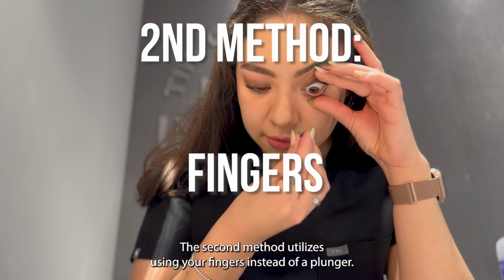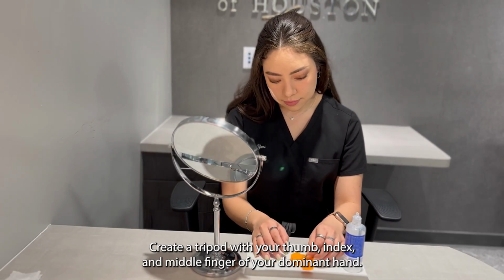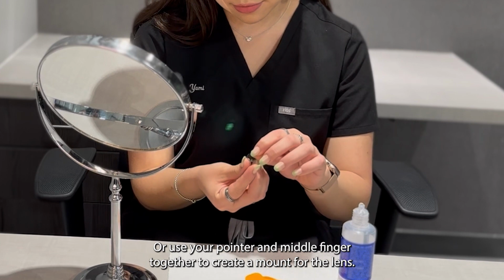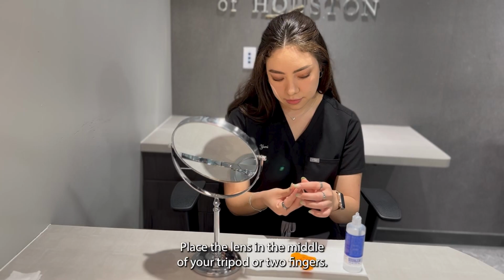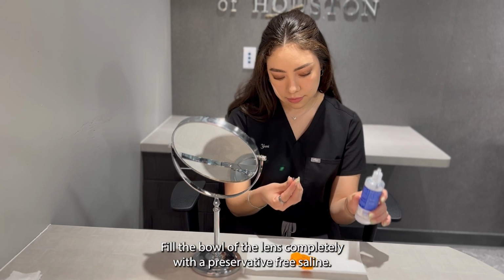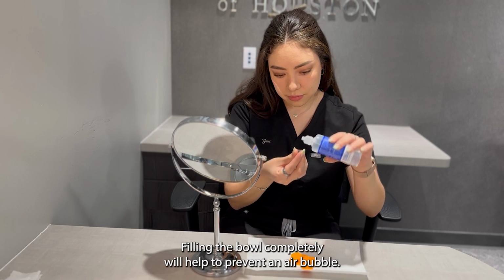The second method utilizes your fingers instead of a plunger. Create a tripod with your thumb, index, and middle finger of your dominant hand, or use your pointer and middle finger together to create a mount for the lens. Place the lens in the middle of your tripod or two fingers. Fill the bowl of the lens completely with a preservative-free saline. Filling the bowl completely will help to prevent an air bubble.